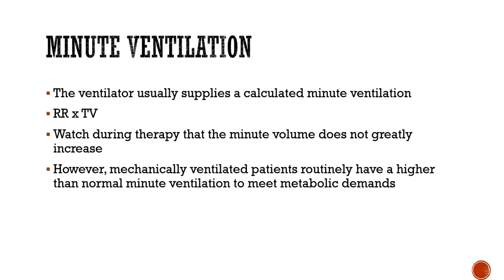And it's actually the amount of air a person takes during each breath. So normal respiratory rate is 12 to 20-ish or so, give or take 14 to 18, somewhere in the 12 to 20 range. So minute ventilation is tidal volume times respiratory rate.